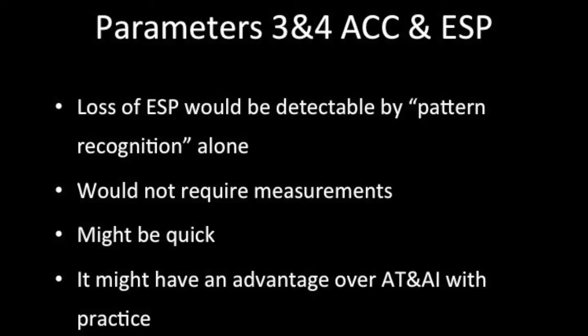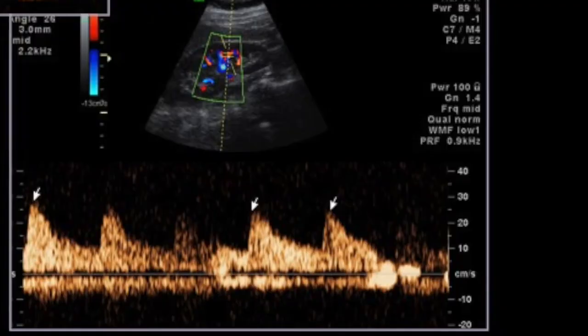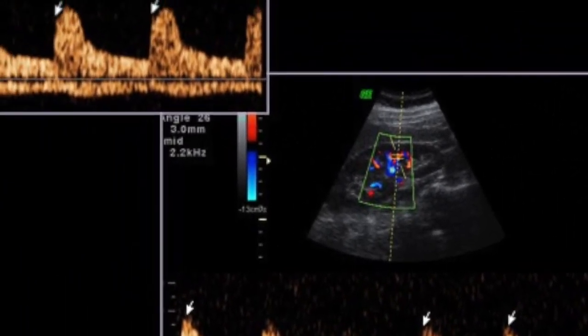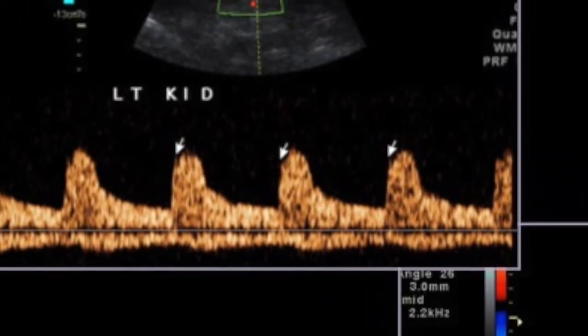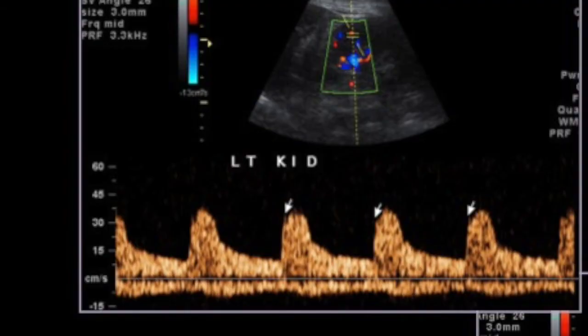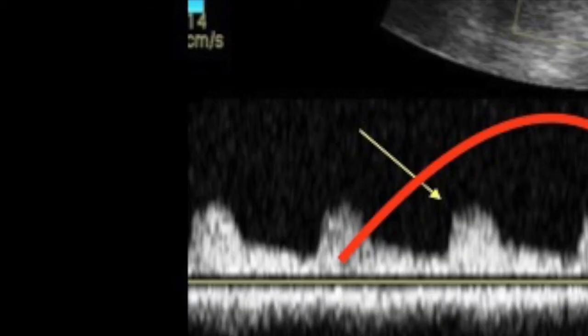Parameters 3 and 4 were acceleration and the early systolic peak. Loss of early systolic peak would be detectable by pattern recognition alone — it would not require any measurements, and with practice it may have an advantage over AT and AI. One must learn to identify the early systolic peak. When the spectrum is broad, one has to understand that the systolic peak is at a specific location and not at another.